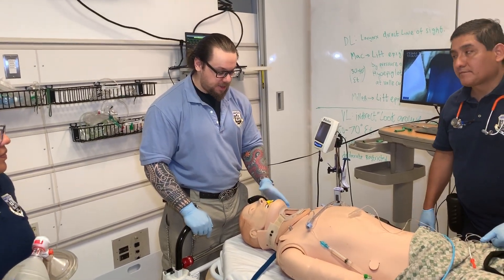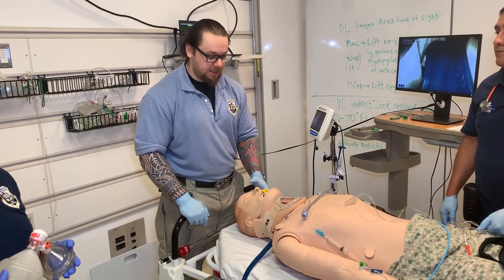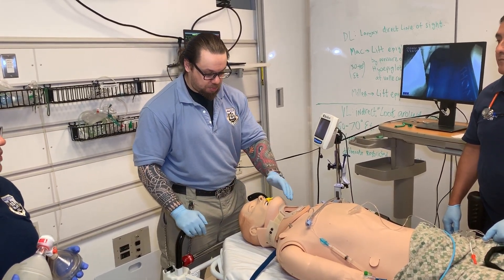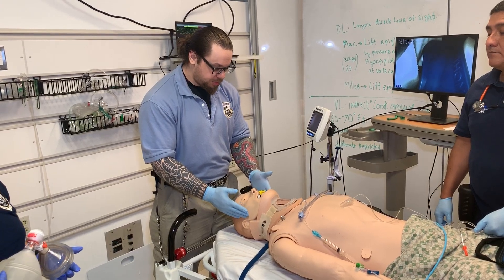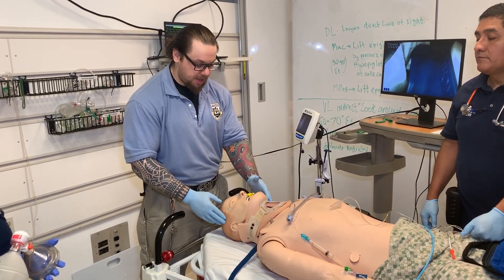My name is Nikolai Yusupov and in this video I'd like to show you how to intubate somebody who has a traumatic injury, and specifically who has a cervical spine injury. This patient has a cervical collar in place. You may get this patient brought to you by the fire department or BLS who has already applied the cervical collar.